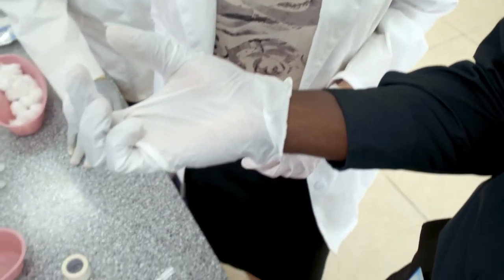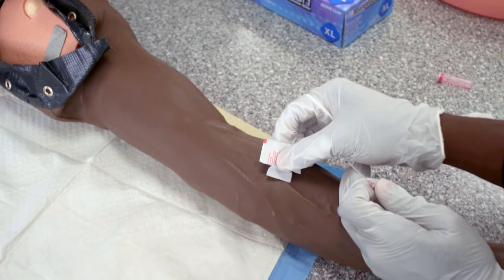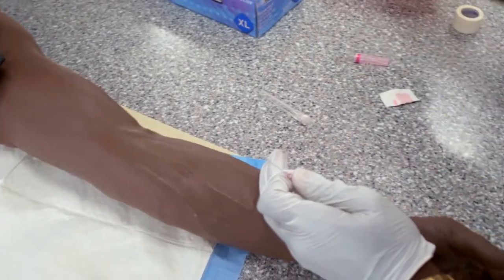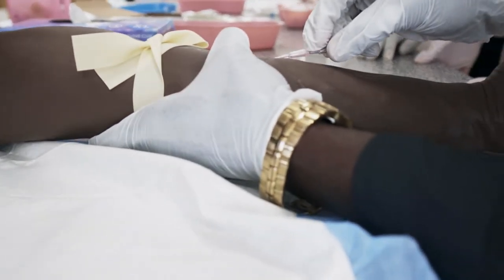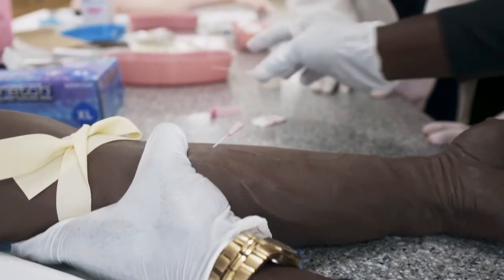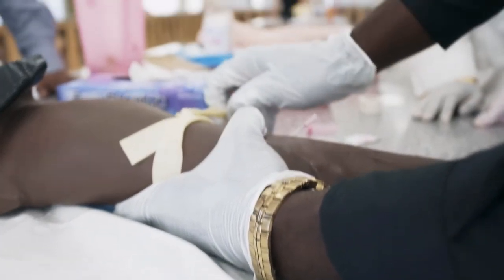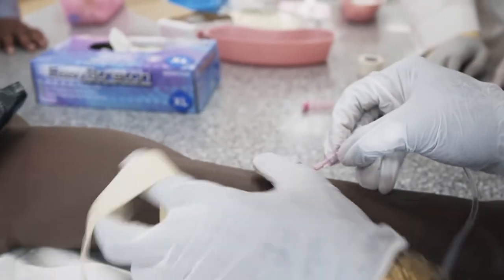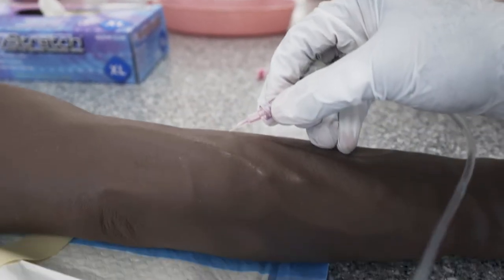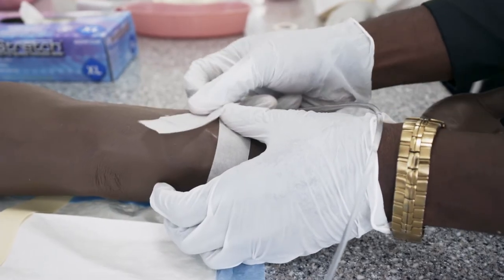I'm going to use these two fingers to help retract the skin. For instance, let's say we're going to use this vein. We clean the area in a circular motion. Once you have done so, dispose, squeeze, and retract. Now, once you have done so, you want to make sure you release the tourniquet, and you place it on top. Once you have it on top, this is the point at which you can release it. Hold it in place. I'm going to make your butterfly.